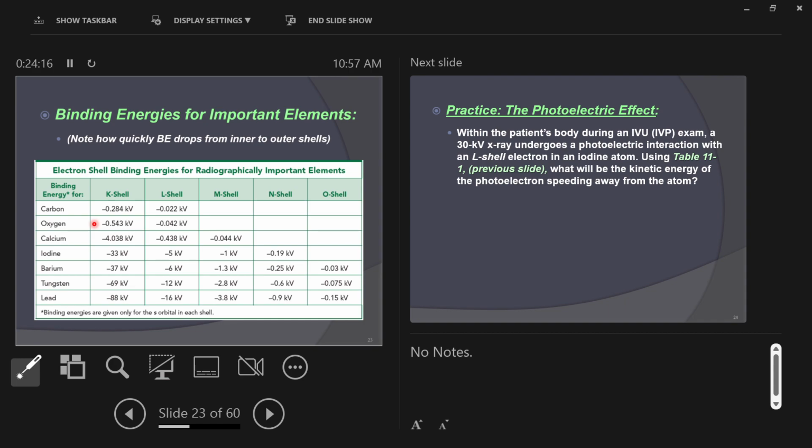Because we have to have a vacuum, otherwise you would have a lot of interactions with oxygen. Yeah, exactly right. So you build up pressure. And so you would have a lot of interactions, meaning the electrons in the X-ray tube wouldn't be able to get from cathode to anode without running into a ton of oxygen molecules and ionizing all of them, right? And dumping all the energy in all different directions, right? And then you might get damage to the cathode, right? But importantly, you wouldn't make X-rays, right? You might make some, but way less and be way harder to gauge how many you're producing. So we need the vacuum in the X-ray tube. Yeah, you're very good, very good.